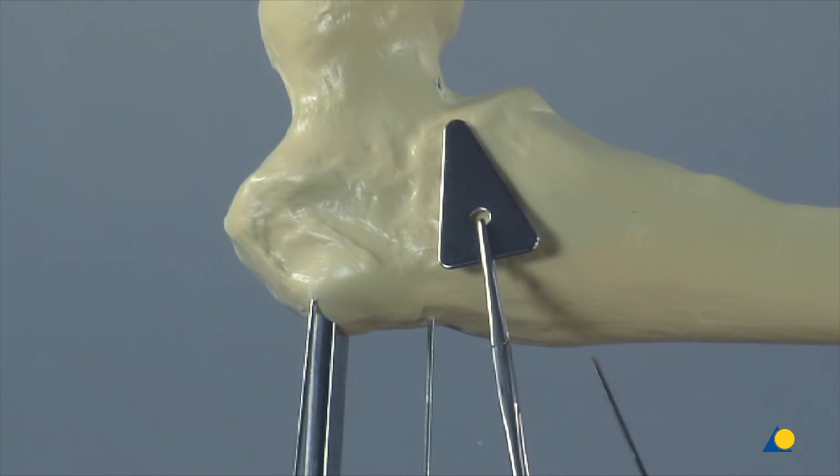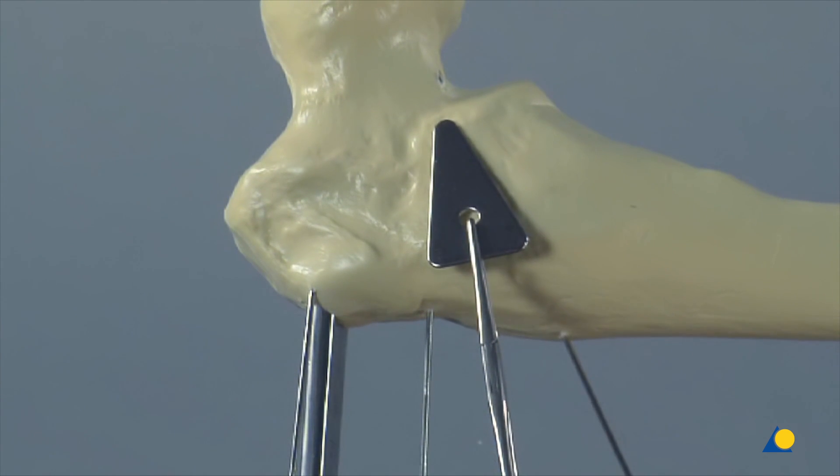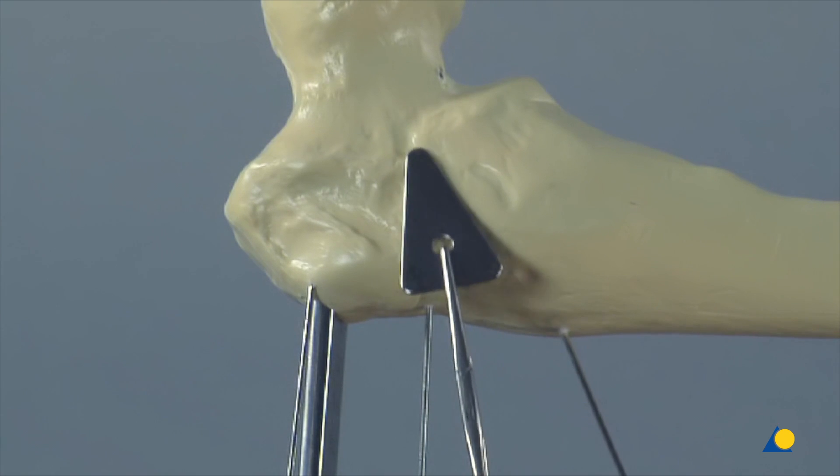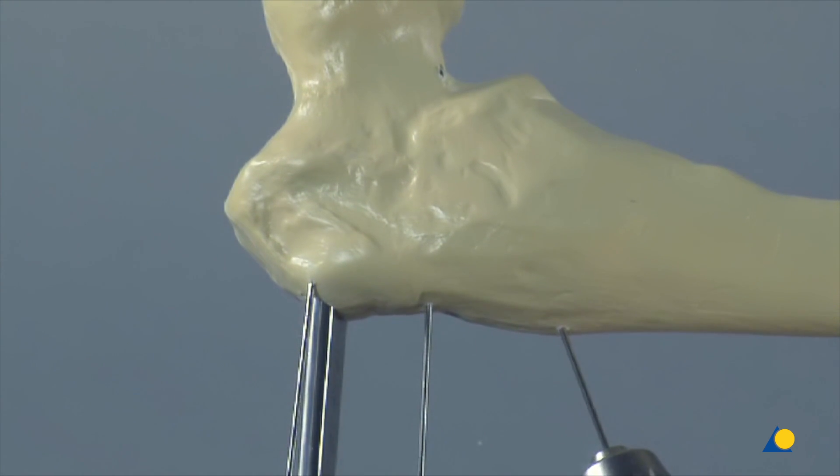Another K-wire is inserted from distal towards the medial cortex using the triangular positioning plate to help align it to the 30 degree angle of correction relative to the previously inserted K-wire in the AP plane.